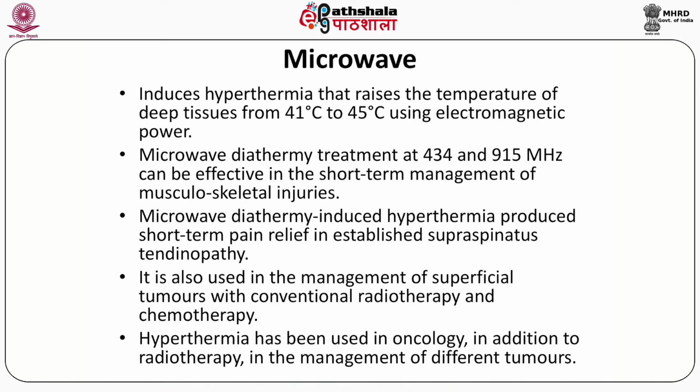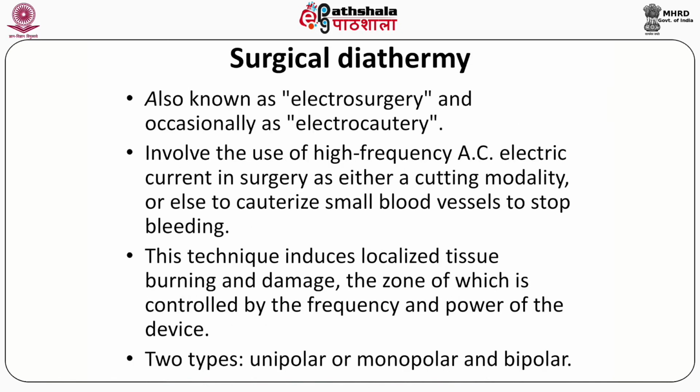Hyperthermia that is produced by microwave diathermy has been used in oncology in addition to radiotherapy in the management of different tumors. Coming to our second but most important use of this diathermy, that is surgical diathermy.